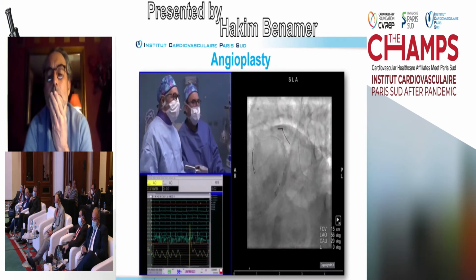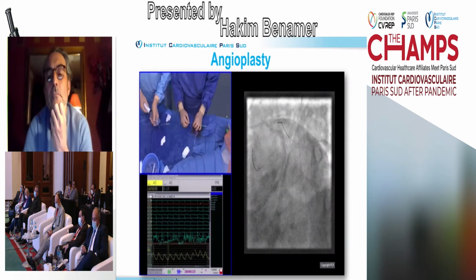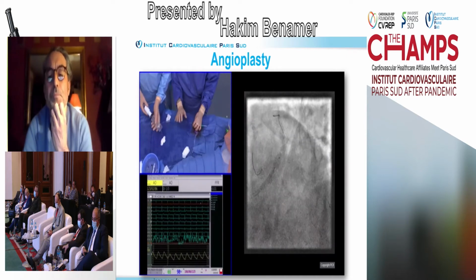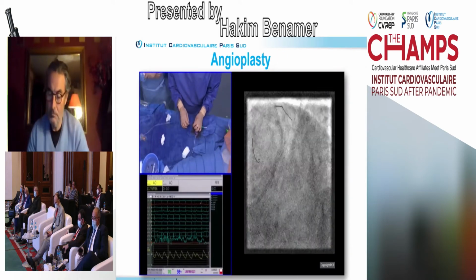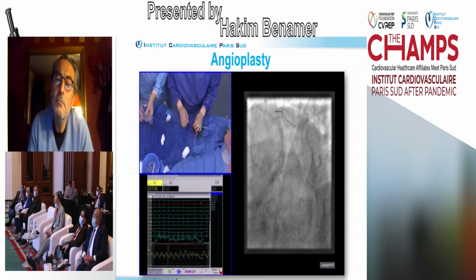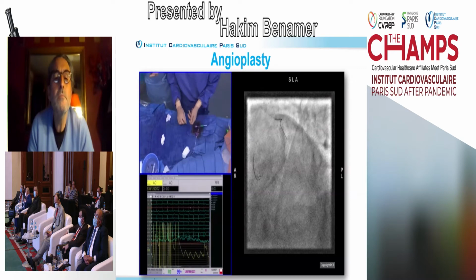And the other aspect that we were just seeing now in the last part is how nicely they were using stent enhancement angiography to make decisions as to where to perform POT. As you can see, they have beautifully identified the edge of the stent, and that's where they are performing it. Remember that it was mentioned before that when you do POT, you have to position always, be careful not to displace the carina or bifurcation. So this is a beautiful illustration of how to use these techniques in real life.